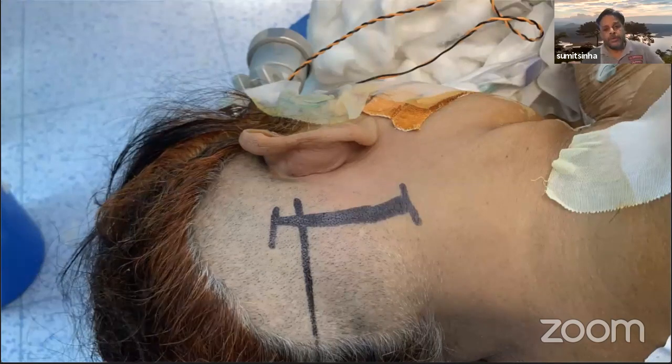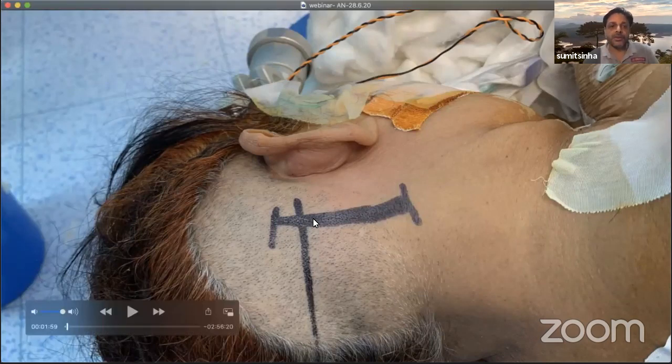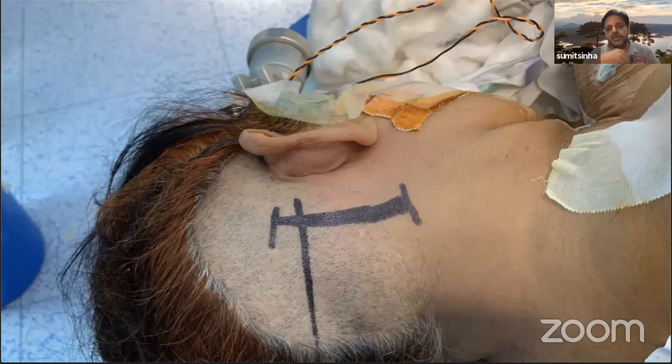Now, certain things you have to keep in mind while you are giving a keyhole incision. As I already mentioned, keyhole is not necessarily a 1 centimeter or a 2 centimeter incision. The keyhole in different acoustics is tailored according to the size of the tumor, the location of the tumor, the extent of the tumor into the meatus, and the extent of the tumor medially into the brainstem. So this was the chosen incision in this patient. And as you can see shortly, this is how it looked.